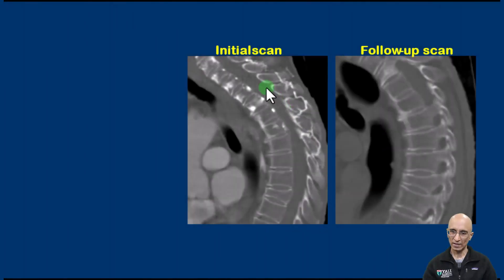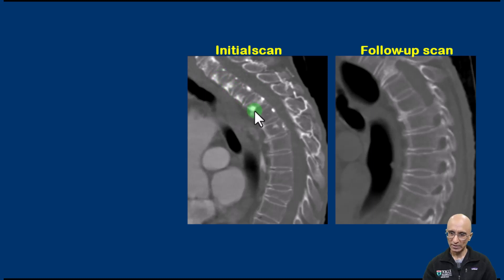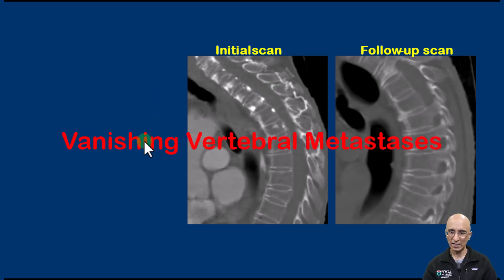Comparing the initial scan and the follow-up scan: on the initial scan performed with intravenous contrast we can see multiple sclerotic foci in the upper thoracic vertebrae, which appear to be connected to collateral vessels anterior and posterior to the vertebral bodies. These were not seen on the follow-up scan performed without intravenous contrast. The imaging appearances are consistent with what is called vanishing vertebral metastasis.